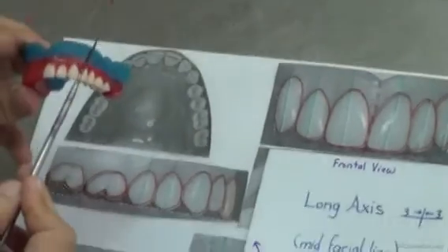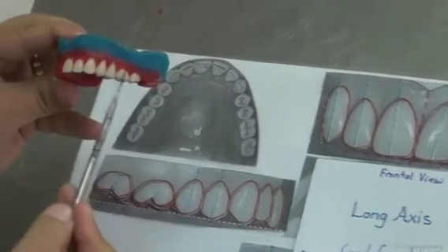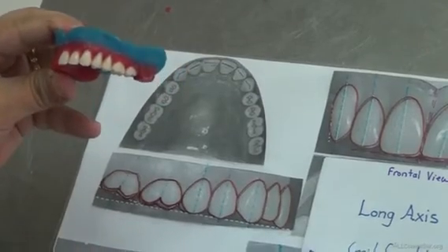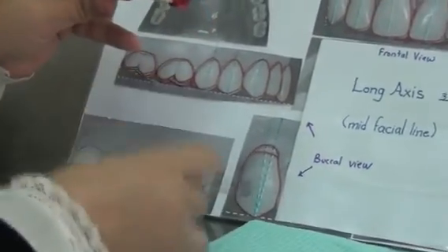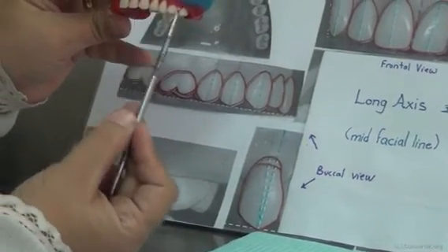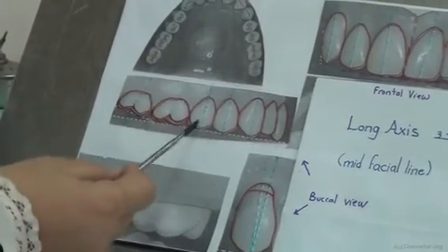The canine has 2 options. You can put the canine upright. I'm looking now between buccal and frontal view, directly at the canine. I have 2 options for setting up the canine: the first option where I could put it upright, or I could tilt it slightly distally. So, 2 options for the canine setting. The premolars are upright, both of them.